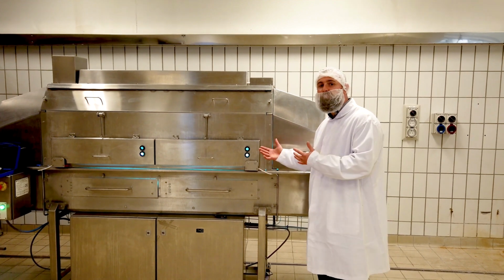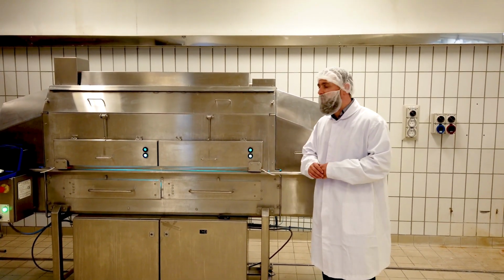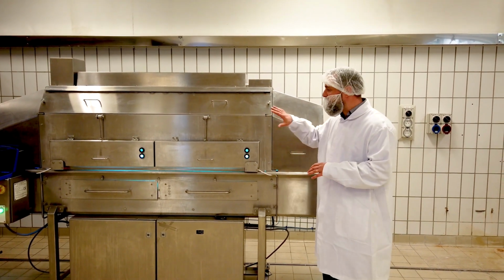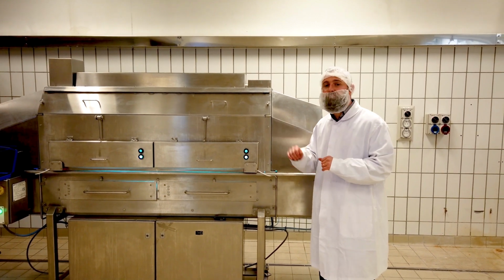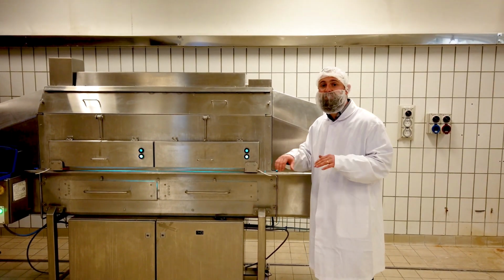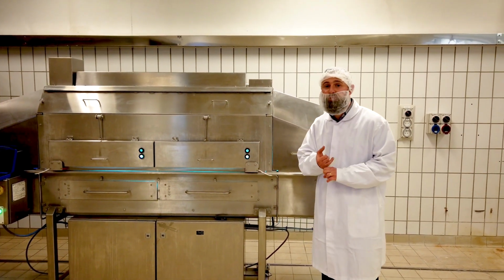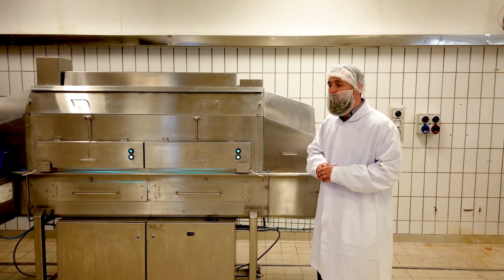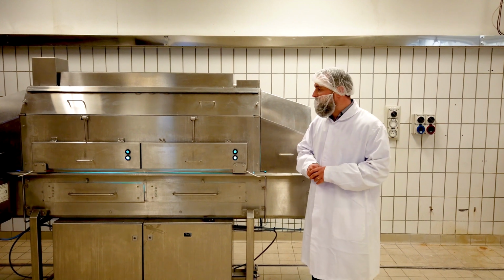This is our ultraviolet light tunnel. This operates in the spectrum of the UVC band, which is from 200 to 280 nanometers. Most of the lights that are in here are at 254 nanometers, and that wavelength absorbs into the bacteria's DNA and inactivates it. UVC has a wide range of applications from fresh produce, baked goods, surface decontamination, shelf life extension, through to on-the-farm treatments to extend the shelf life of fresh produce.